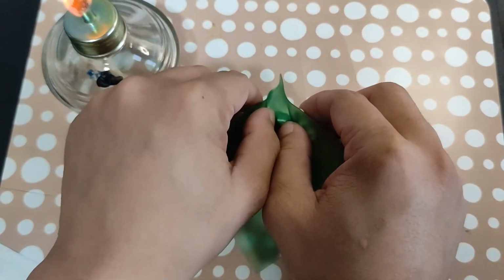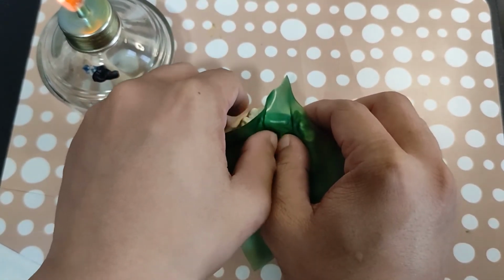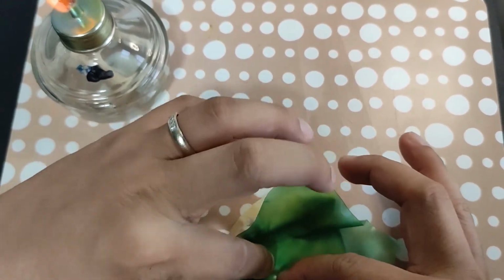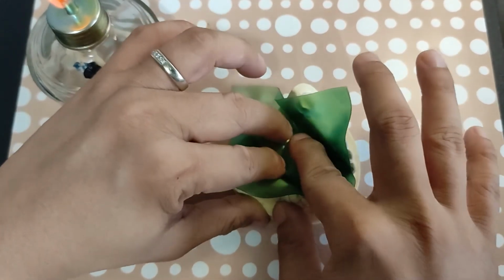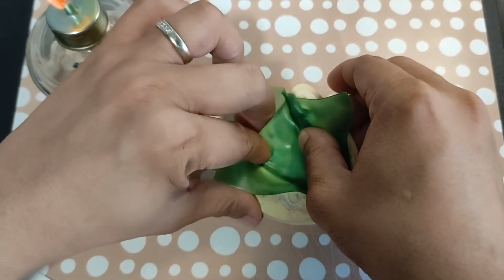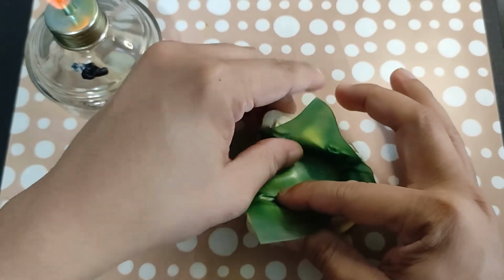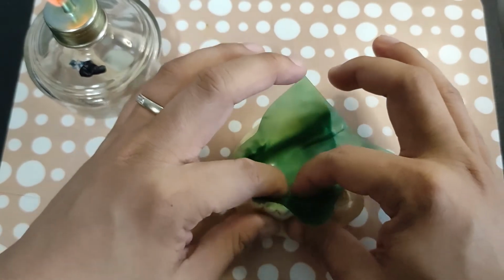So we start out at the anterior. That's the first layer.